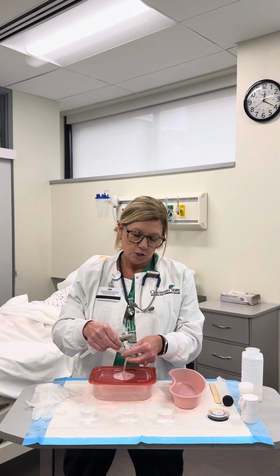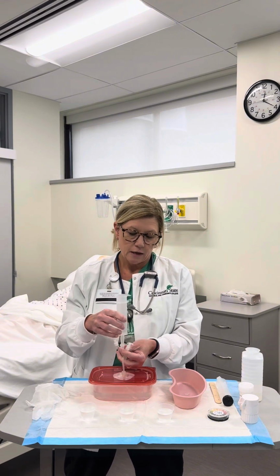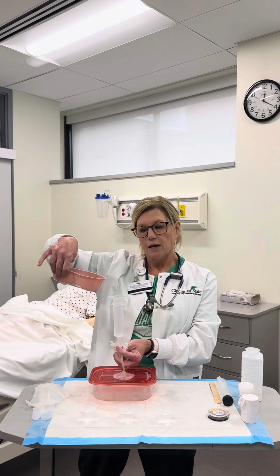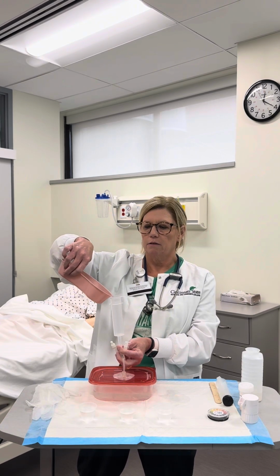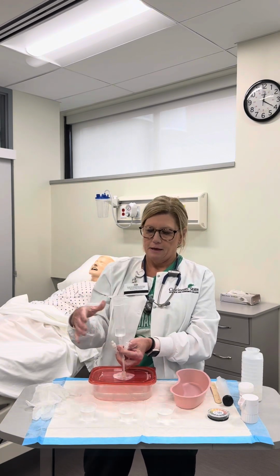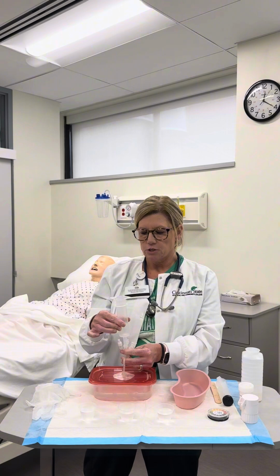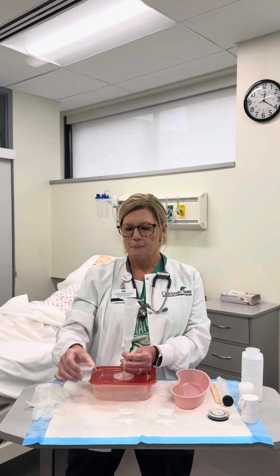So the first thing I want to do, I'm going to pinch that tube, put the plunger in, and first I'm going to give back the residual. I want to give back the residual because I don't want to cause my patient to have a fluid or electrolyte imbalance, so I'm going to give them back what was in their stomach. Okay, give that back. And then as soon as I raise up the syringe, it's going to go in by gravity. As soon as it gets down into the tube, I want to pinch it down again because I don't want a lot of air going in.